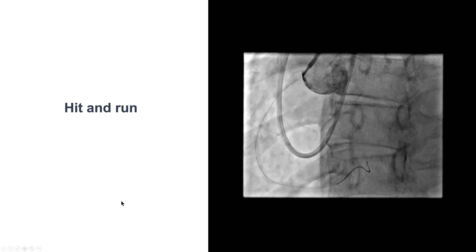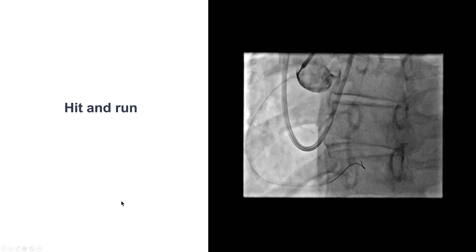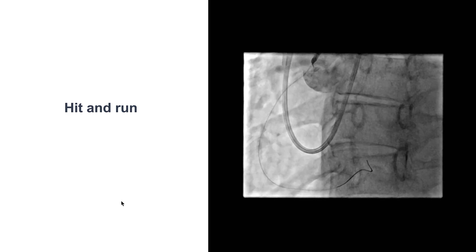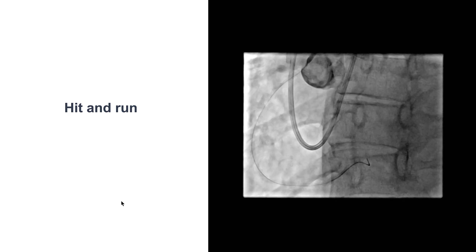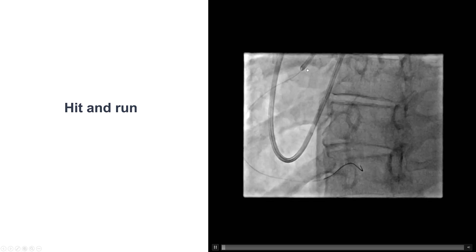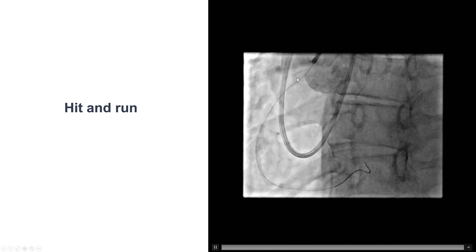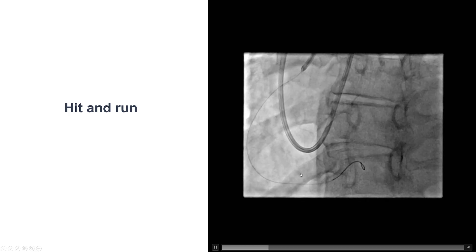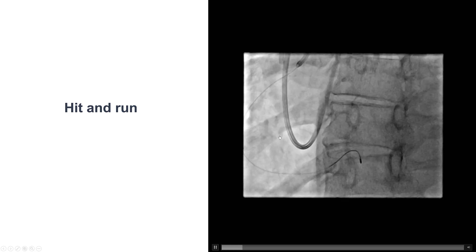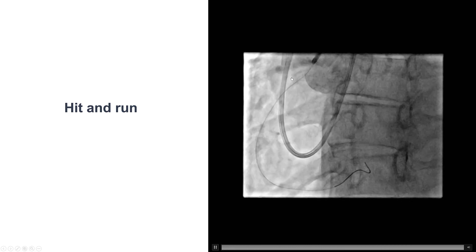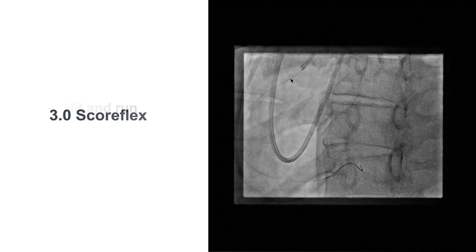Right heart catheterization showed normal filling pressures, so we proceeded with PCI without hemodynamic support. There was significant dampening of pressure upon engagement of the right coronary artery, which is why we downsized to a 6 French from a 7 French JR4 guide catheter, inserted a guidewire into the coronary artery, and performed the PCI with the guide being disengaged from the ostium of the right coronary artery.